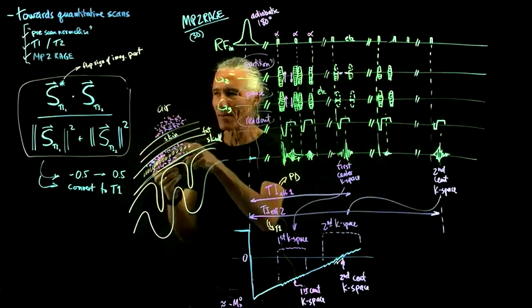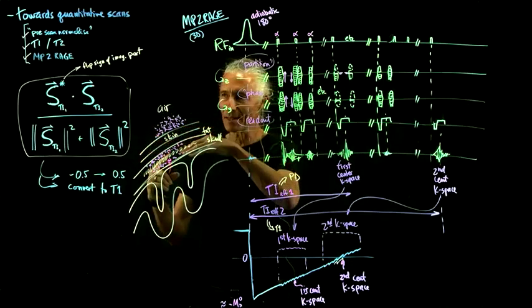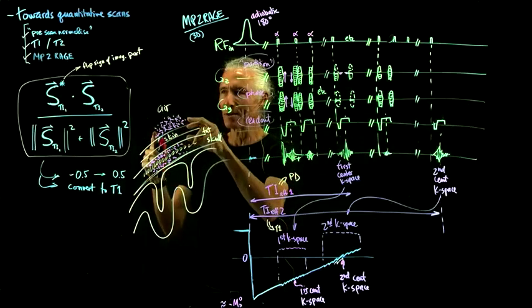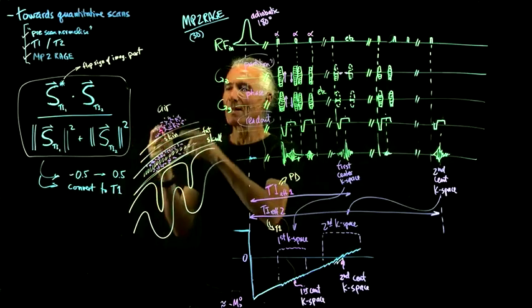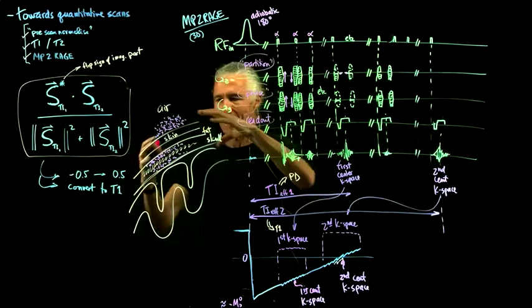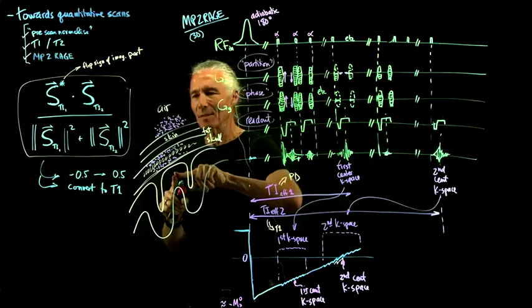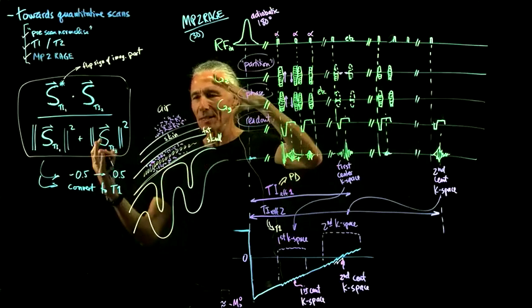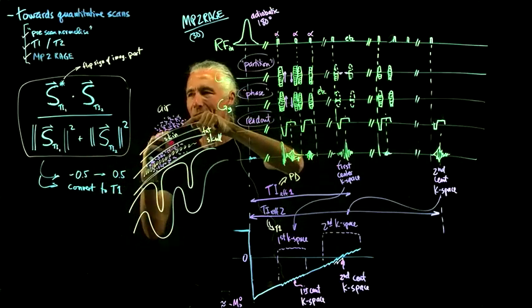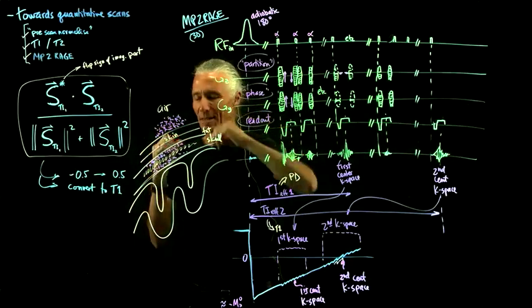It's a little harder to find the skull, because you have to somehow find out where the skull is in order to mask it. The air is relatively easy because you could just turn off anything that's black outside. The proton density image is not going to distinguish the black inside from the black outside, but if you shrink a surface onto the skull, we can get rid of the noise outside the skull.